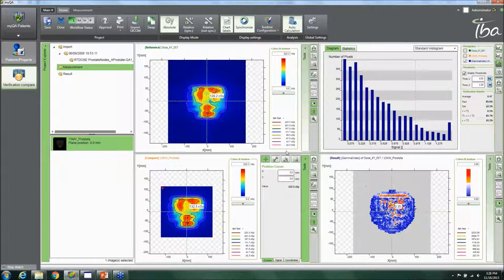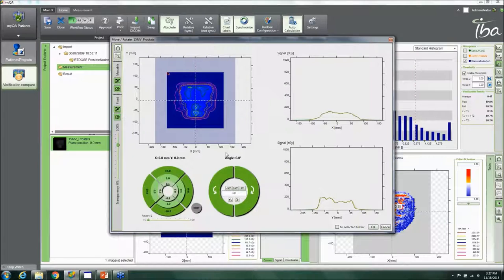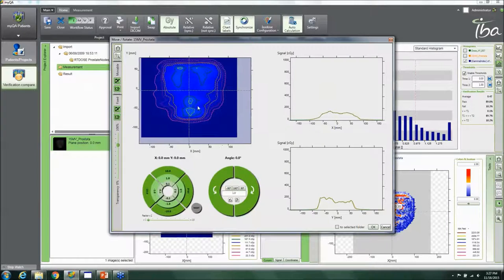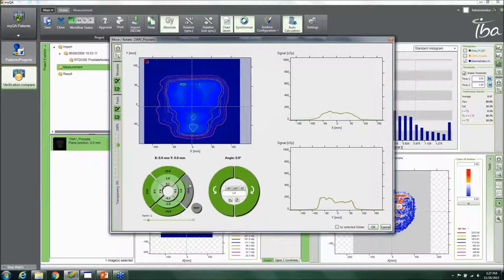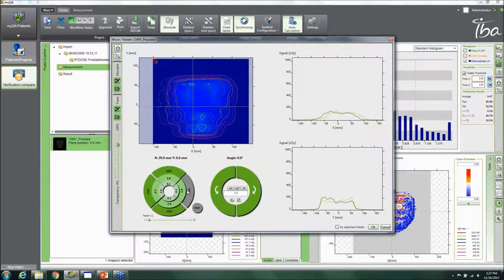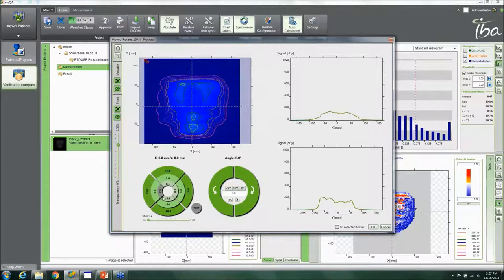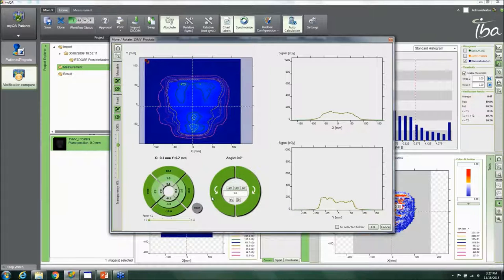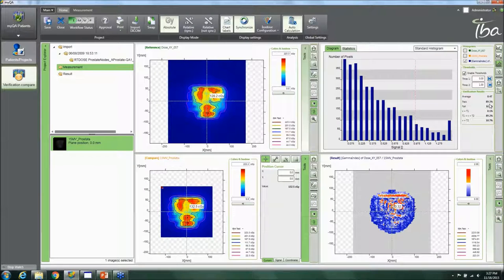The gamma calculation returns, for example, 89.8%. If you suspect there was a slight setup uncertainty — meaning the detector wasn't positioned quite accurately — you can use the Move and Rotate Data tool. This lets you look at the individual isodose lines and profiles, identify a possible slight rotation or offset, then move the measurement in X or Y. The display tells you exactly how much you're moving and by what angle, and you can set a specific angle value. After adjustment, the software recalculates and reports the new passing rate.